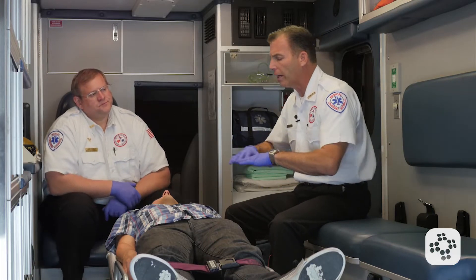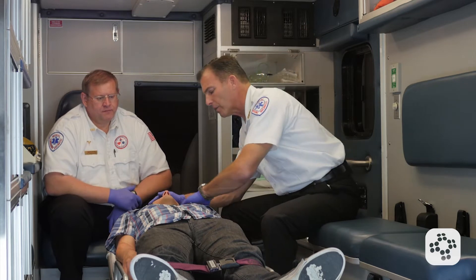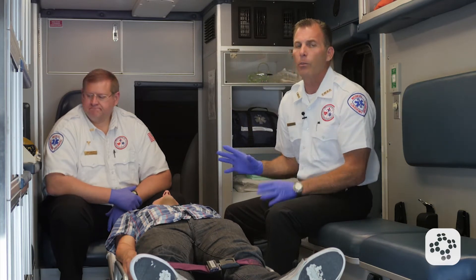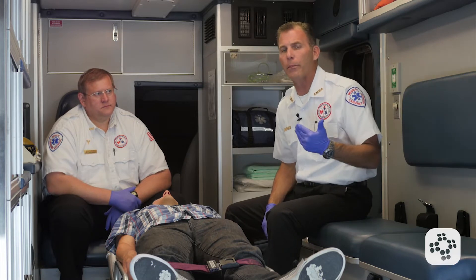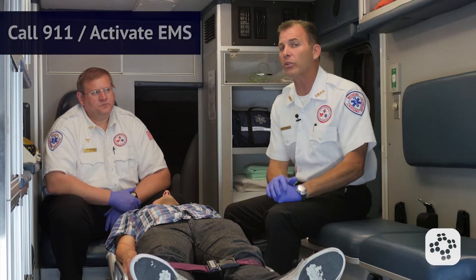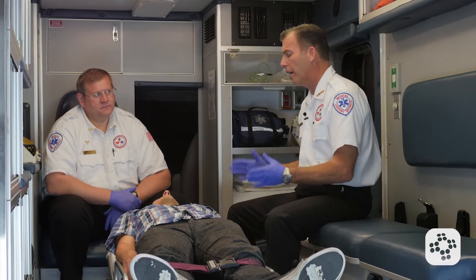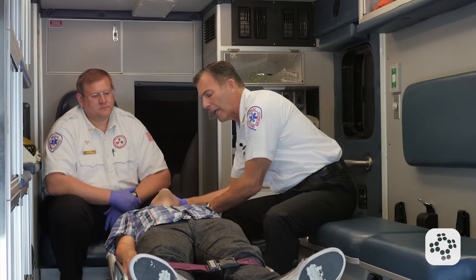So we're going to go ahead and assess our patient now. Sir, can you hear us? Can you hear me? There's no response. Tap and shout on the collarbone — sir, can you hear me? There's no response. Now, of course we already have our AED, but if we didn't, we could send somebody to go get one or a crash cart. In this case, we're going to tell somebody to go activate EMS or call a code. 911 has been activated, the code has been called.